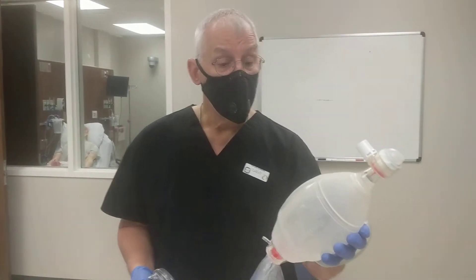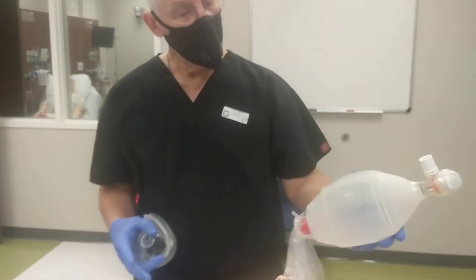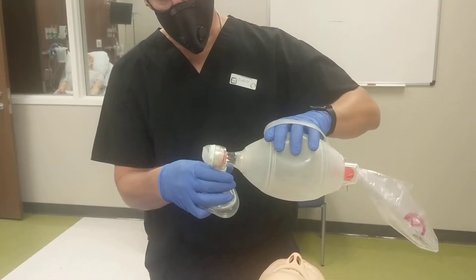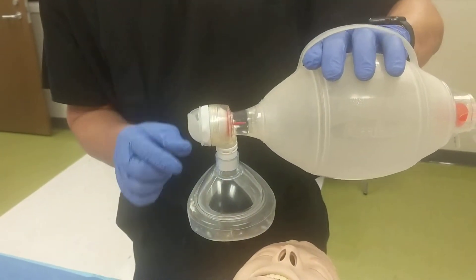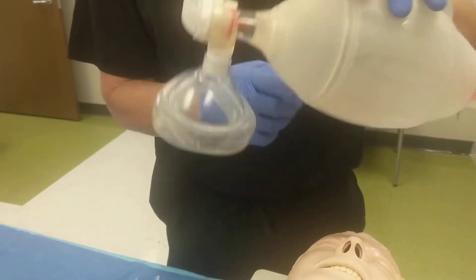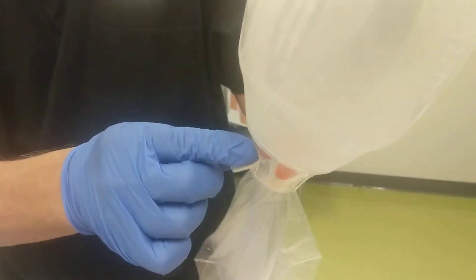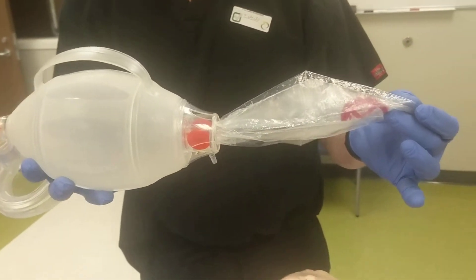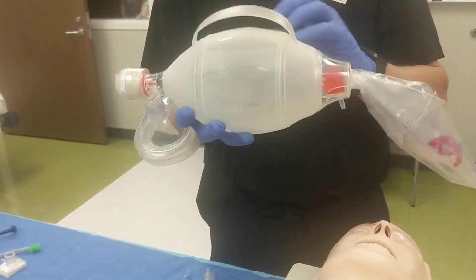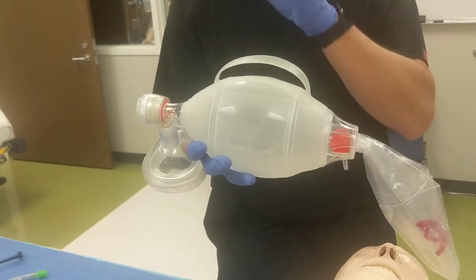This is a standard Ambu bag. It has a small holster on the top for your fingers and it's easy to squeeze and release. It has a valve that allows exhaled air from the patient to be released into the atmosphere rather than remixing with the air in the bag. There's also a reservoir bag here. High-flow oxygen should be applied to this nozzle, and high-concentration oxygen left in the reservoir bag and in the Ambu bag. As the flow continues, progressively higher FiO2 is accomplished in the delivered breaths.